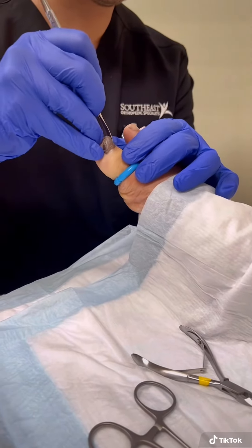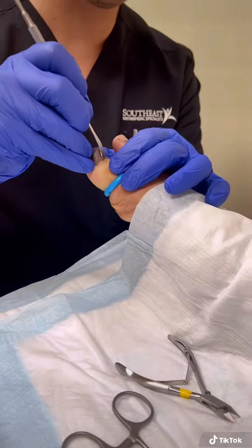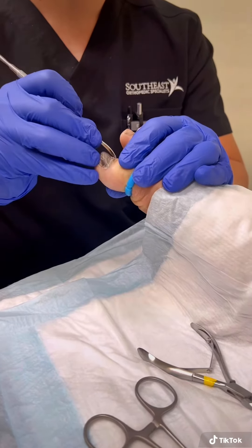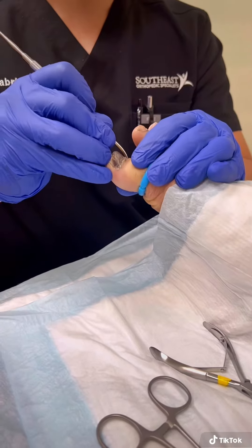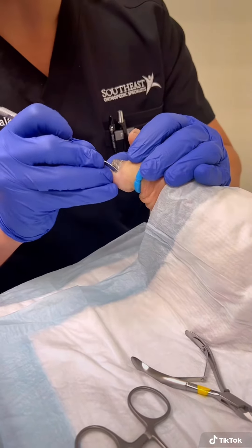The first thing we do is use a freer elevator to go in and start loosening up some of these edges. We're just working our way around. You can see the nails already becoming a little bit loose. So that side's pretty good — now we're going to work on this side.